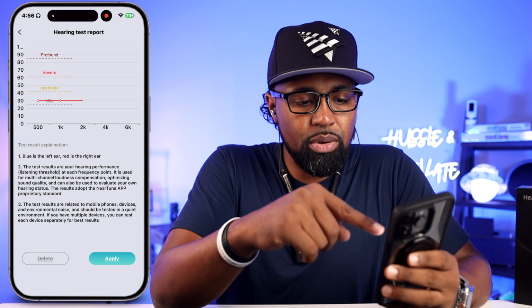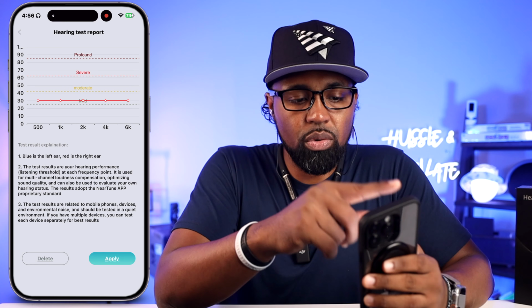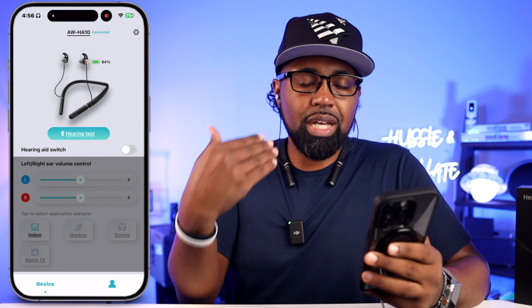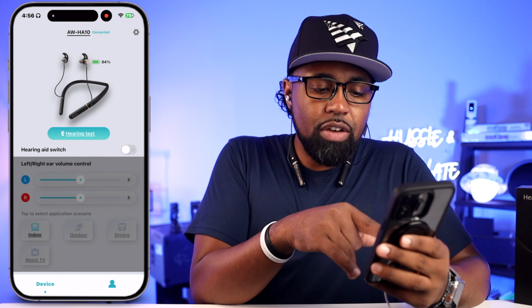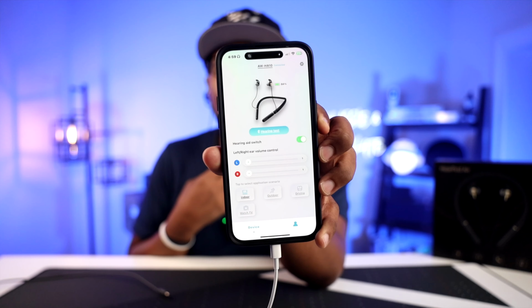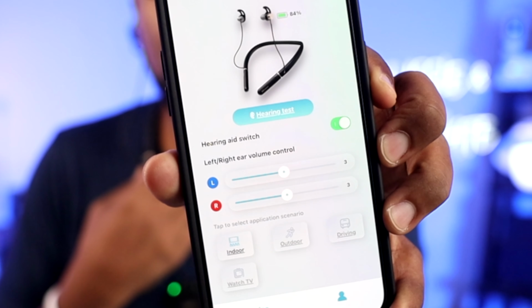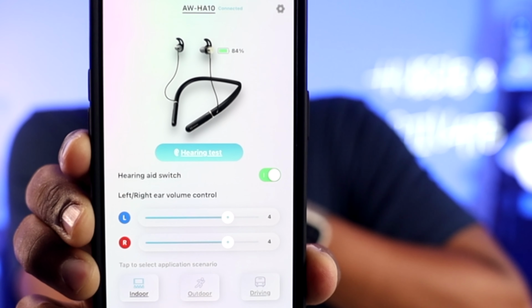And then here's the hearing test from today that I ran, and there's no issues with that. You do have your hearing aid switch right here, which you can cut on and off, and your left and your right volume control. And as you can see, as I turn the right volume up, it all goes up at the same time.